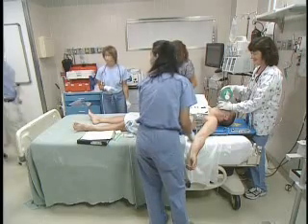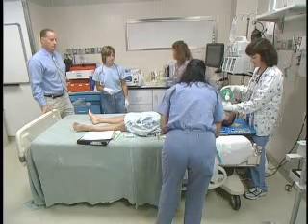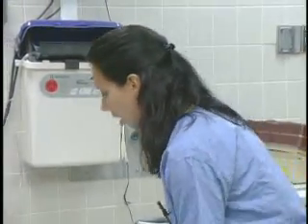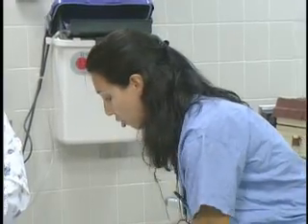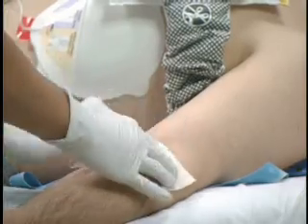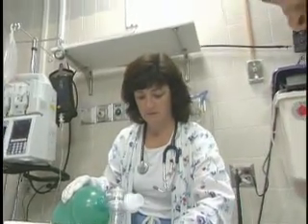Okay, what's going on? Dr. Freitz, this is my patient who was admitted two days ago with chest pain. He went to the cath lab yesterday, had clean coronary arteries on his cath, and I was actually just signing him out to go home. He was getting ready to be discharged and his labs were good. So what have you guys done so far? Nothing — we just applied the auto pulse and started doing CPR.